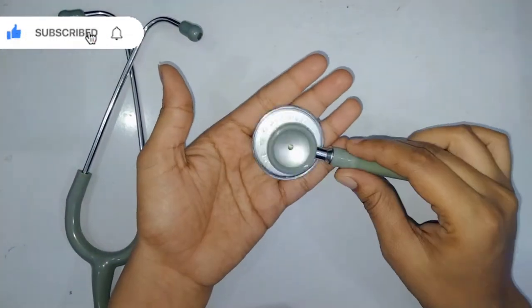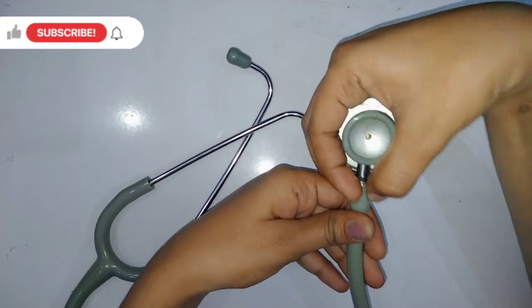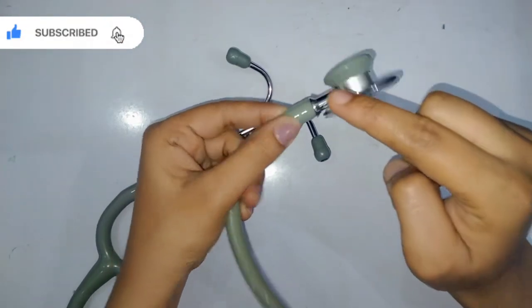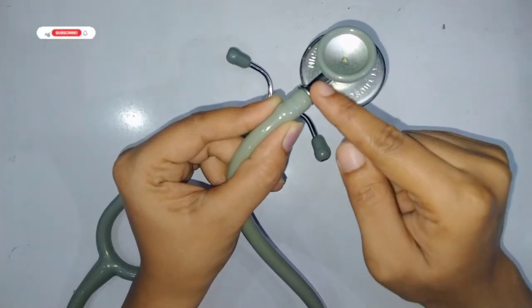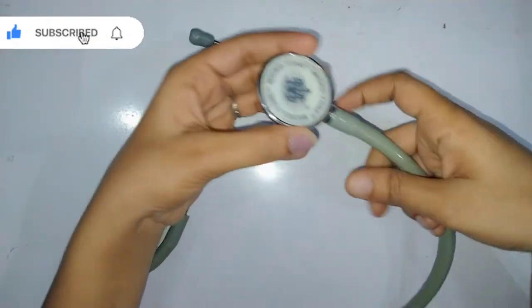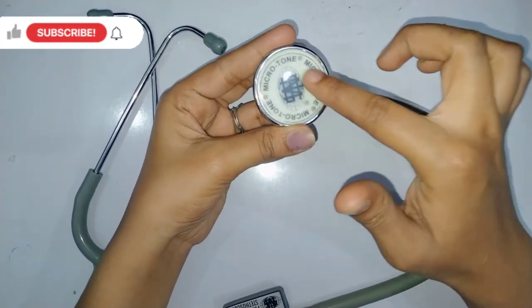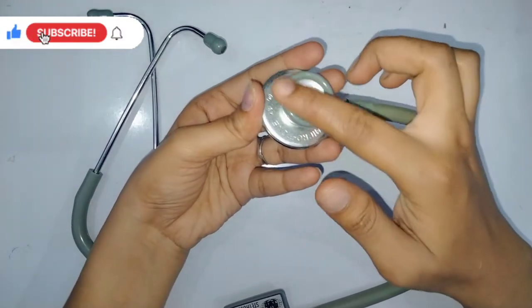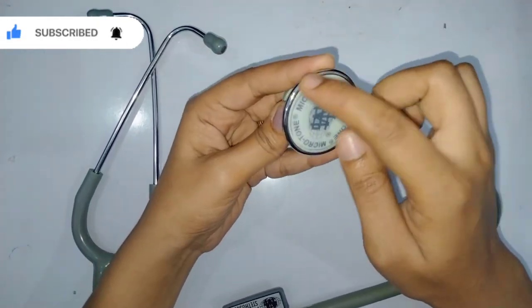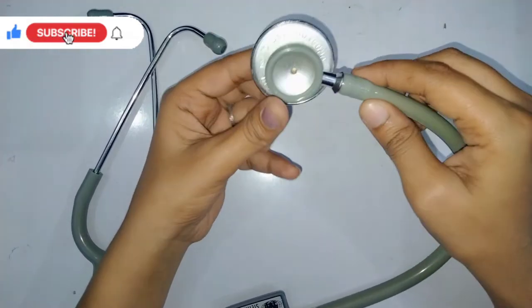The chest piece plays a very important role in diagnosis. The chest piece consists of a bell, a diaphragm, and a stem. The stem is the part that connects the chest piece and the tubing together. The diaphragm detects higher frequencies, while the bell detects lower frequencies. The metal ring that holds the diaphragm tightly is called the chill ring.